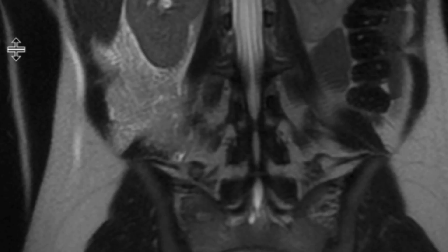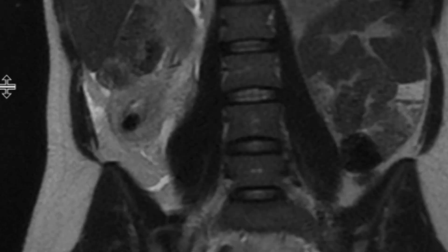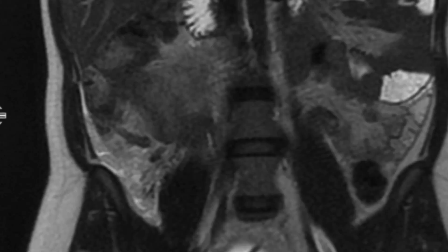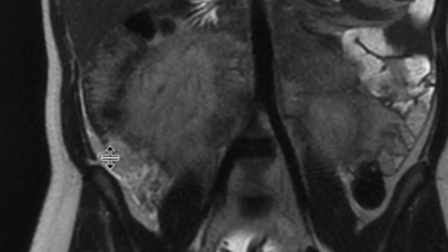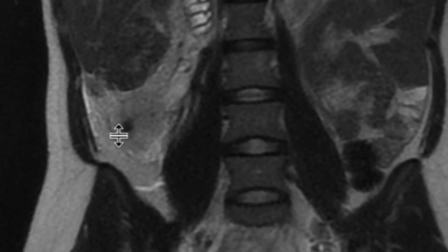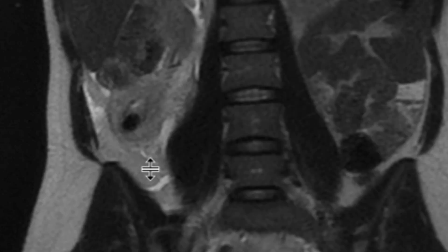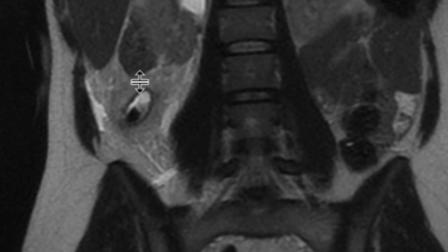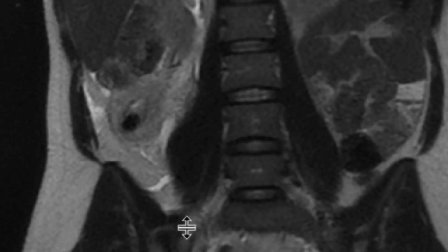These coronal T2-weighted images show the appendix really nicely, coming from the base of the cecum, going up to this area where there's an appendicolith. Beyond that, the appendix is quite distended and fluid-filled, with lots of inflammatory changes.